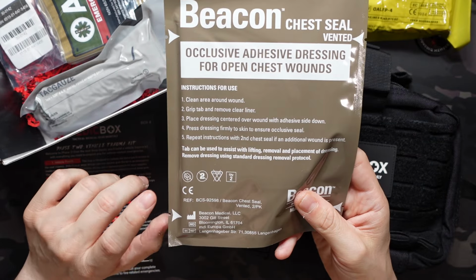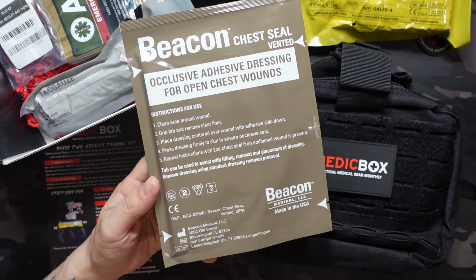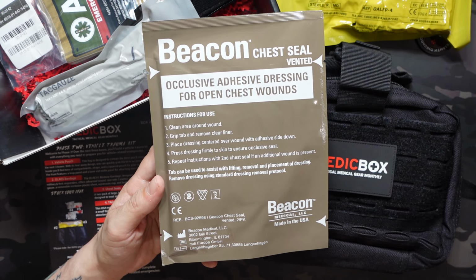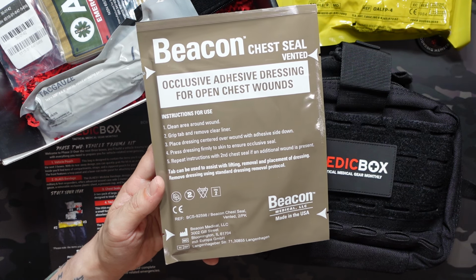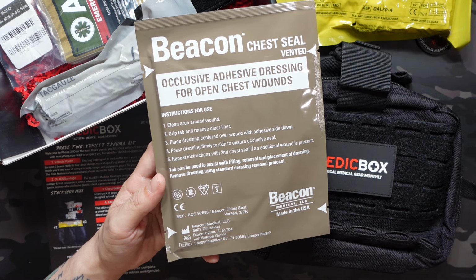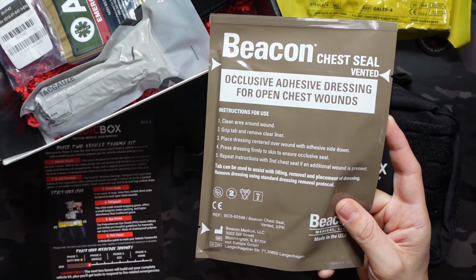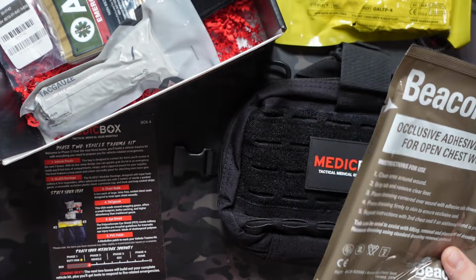Now one thing I wanted to point out about this is because I did make a little bit of a mistake in the video that we got that in the duty first aid kit, and Exploring It All, who has his own YouTube channel here on YouTube, retired law enforcement officer, and is also doing these medic boxes, let me know. I said that I thought they were for through and through wounds where you have a clear entry and exit wound to create some suction and a seal, but that's actually not the case. He let me know he uses these all the time in his career to seal wounds that are just entry wounds. There's no exit wounds. As long as they're large enough to create that seal, they're still very useful. And so I just wanted to kind of clear up that mistake for anyone who watched that and kind of took me at my word for that, that's not actually the case. So a huge shout out to Exploring It All for pointing that out to me.